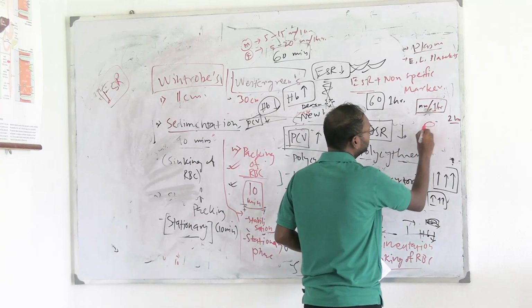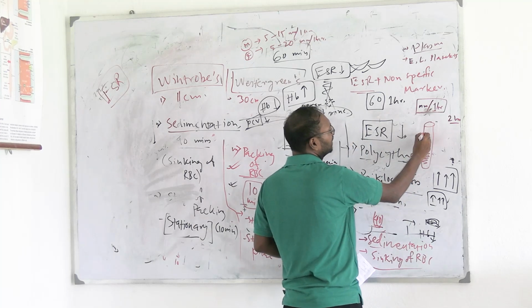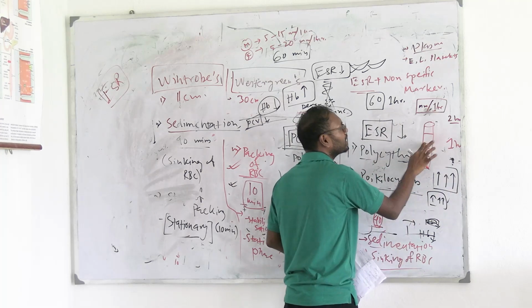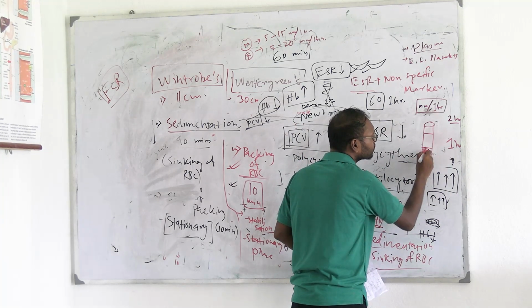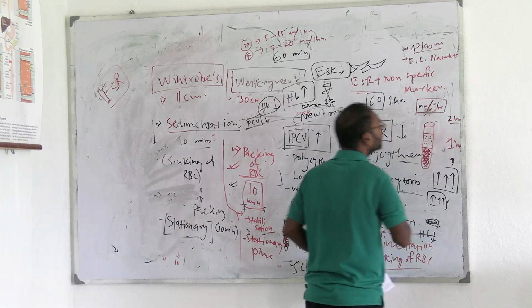So now let's move on to our next logic. What was the logic? We are taking whole blood. Now there is sedimentation already formed. Sedimentation happened after 1 hour. We will be noticing the cells down below, and clear fluid, which is actually plasma, above it.